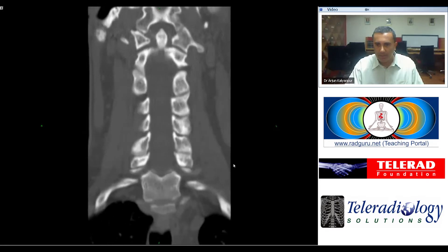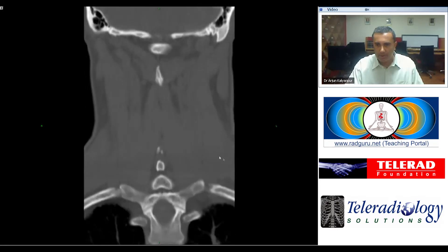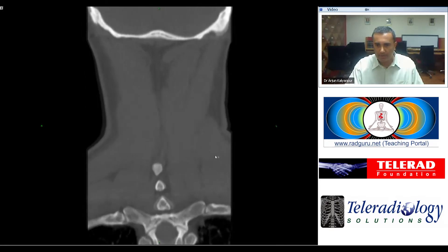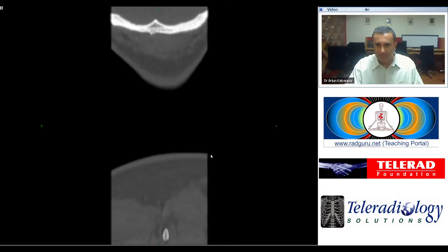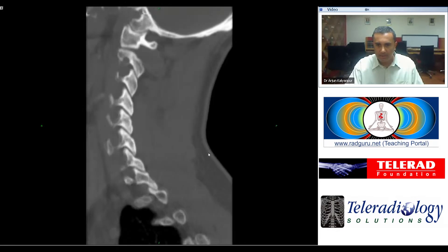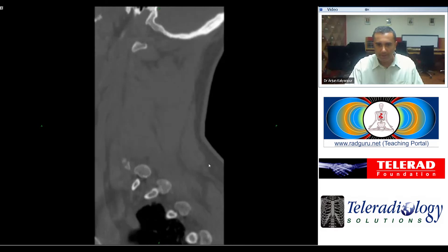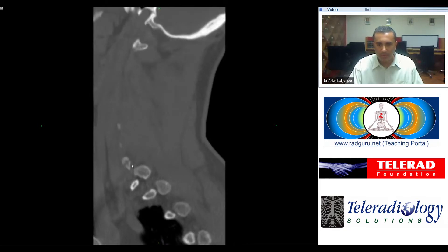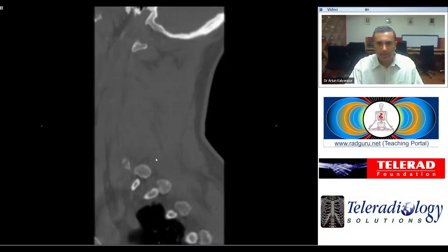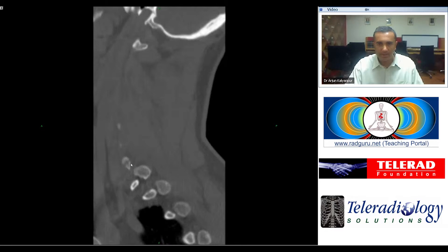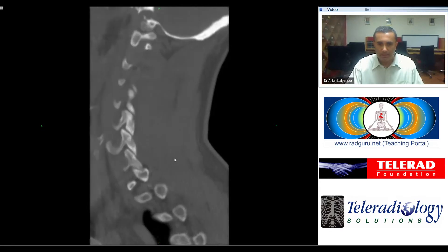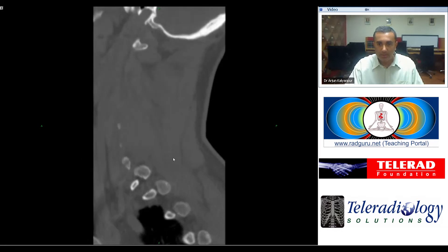And when we proceed to look at the sagittal reformats, the finding becomes even more apparent. You can see it on this image right here, where there is an oblique lucency going across the tip of the transverse process. This is an unmistakable fracture, which on the other views is not so definite a finding.